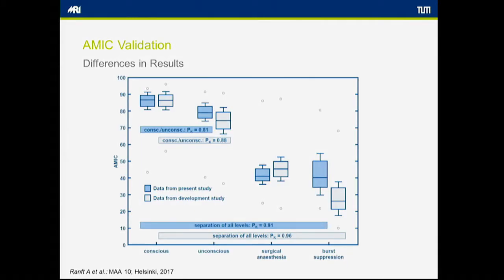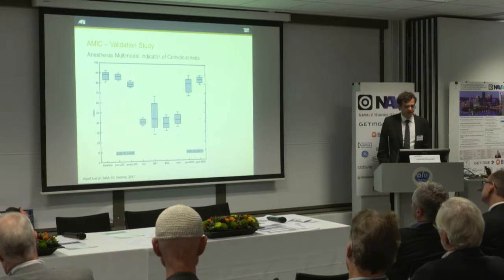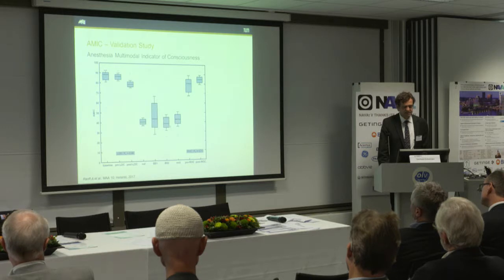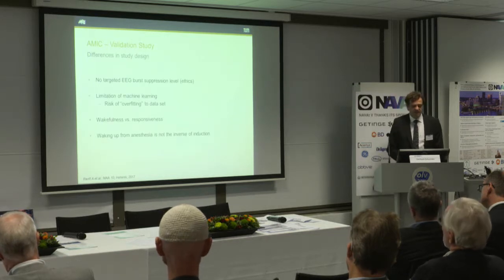And we showed that results in this validation study are fairly similar to the ones that have been shown in the design study. So there are minor differences, and we see that in particular in deep levels of anesthesia, the separation was not as good as it had been in the first study, but that was basically due to some study design issues, because in this study we were not allowed to target EEG burst suppression.